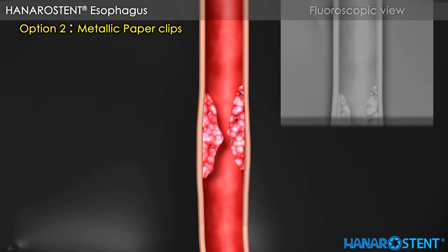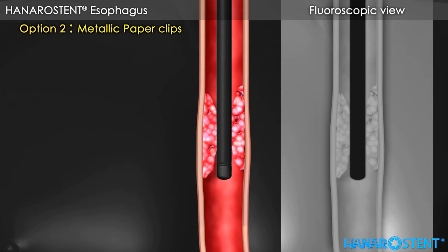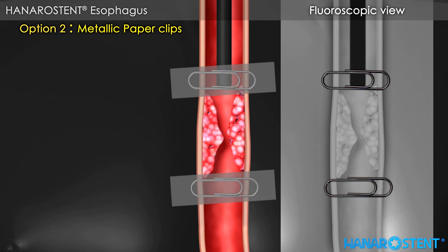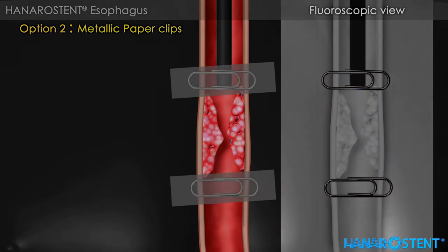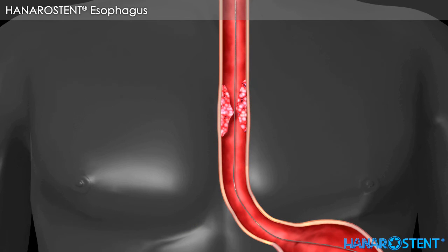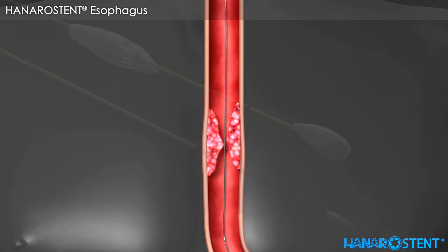A metallic paper clip is another preferred option in order to get an accurate stent positioning with fluoroscopy guidance. Directly fixed with transparent tape on the patient's skin on each end of stenosis. Before introducing the stent, please choose the stent with a length at least 4 centimeters longer than the actual stricture.